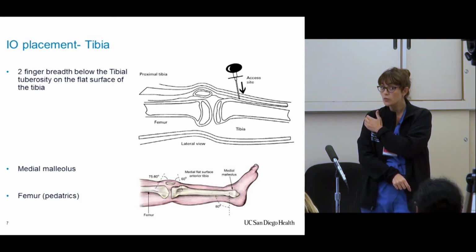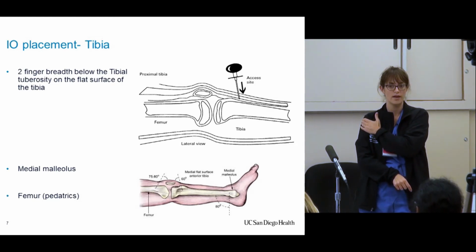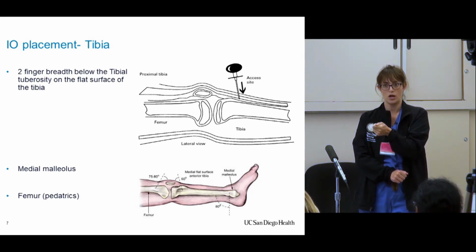You can do it in an awake patient. There are actually lots of videos on YouTube. You can watch people have it done. The humerus is described as sort of like a paresthesia-y kind of feeling. You get kind of a zing when it initially goes in. Of course, just like with any needle, there's a little pain going right through the skin initially. But when it actually meets the bone and goes in, it's more of a pressure feeling, and it is tolerable.